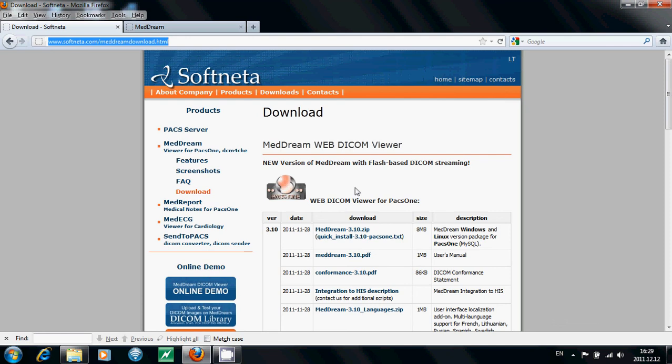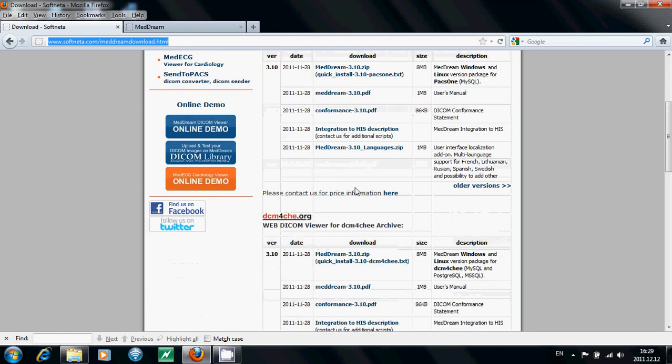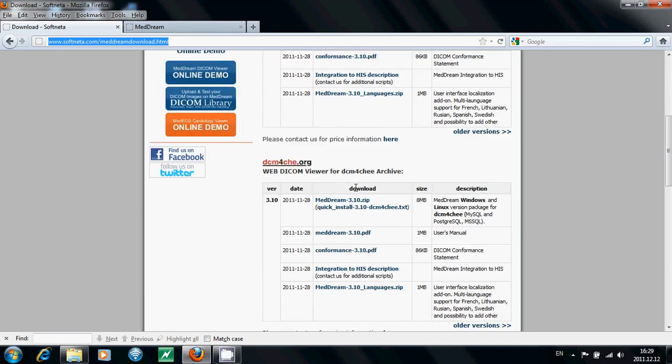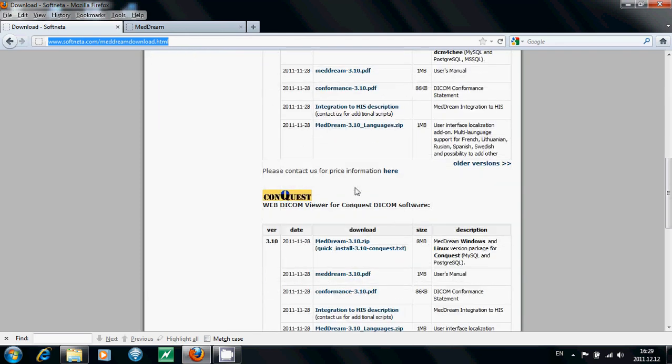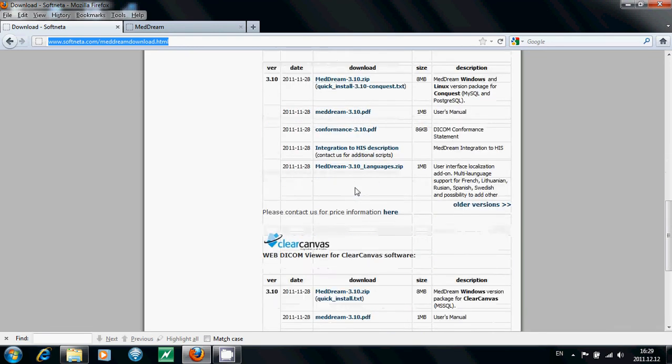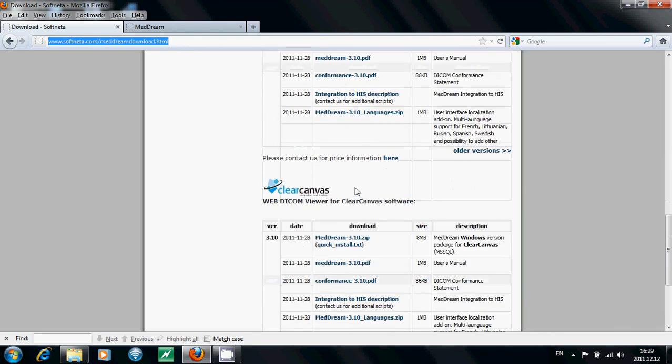MedDream is compliant with the following servers: PACSOne server, DCM4CHEE, Conquest and ClearCanvas.